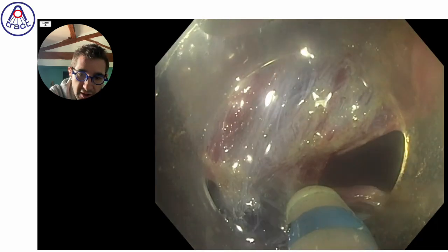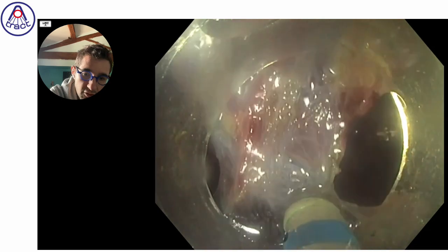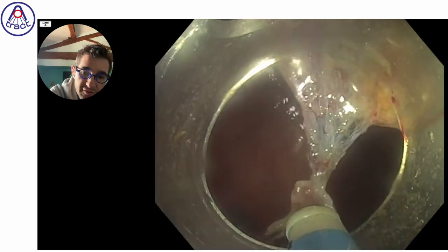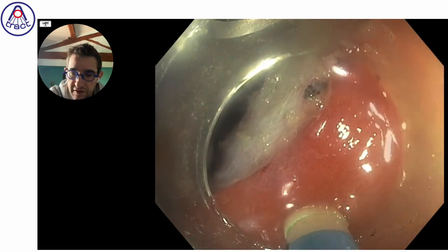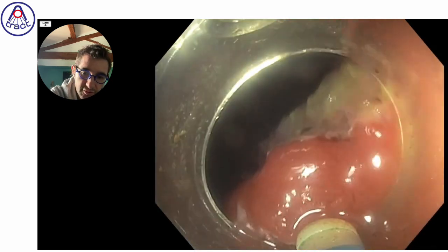And in the strategy, I really like to have this kind of repeated movement to save energy because, for example, this case was the first of the morning but after we still have 3 ESDs to do. So saving time, saving energy is always important for any procedure.